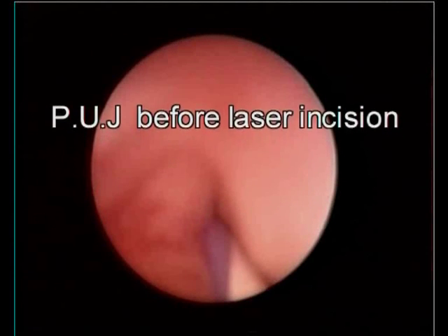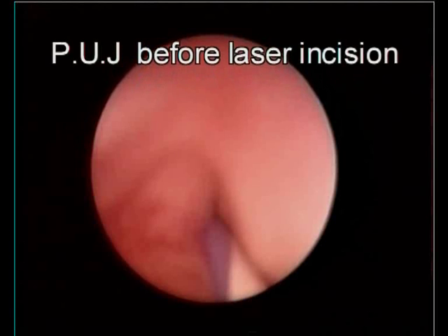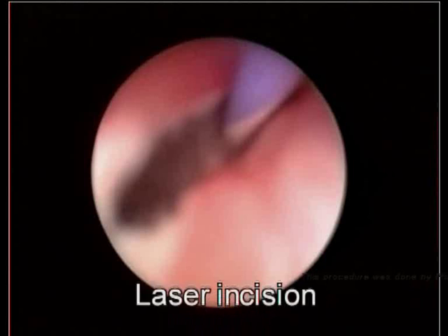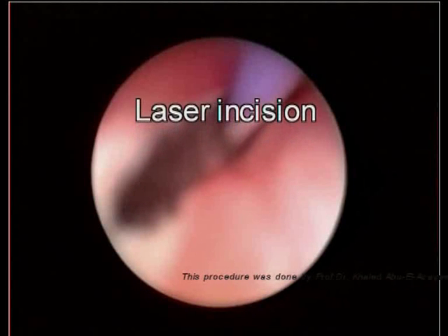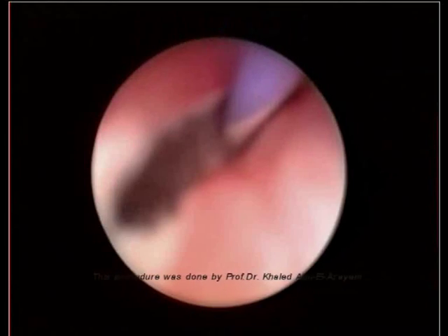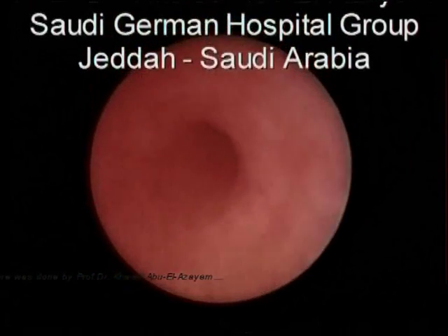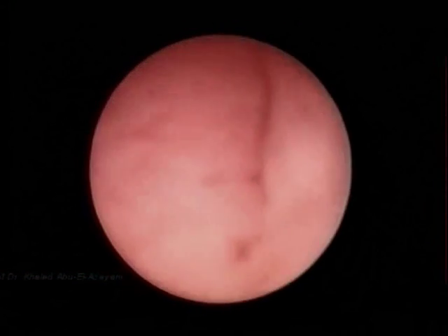The treatment options available include open pyeloplasty, laparoscopic repair, the Acucise device balloon cautery incision, and endopyelotomy. Endopyelotomy is a minimally invasive option for the management of pelviureteric junction obstruction.